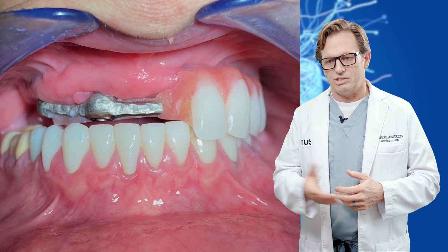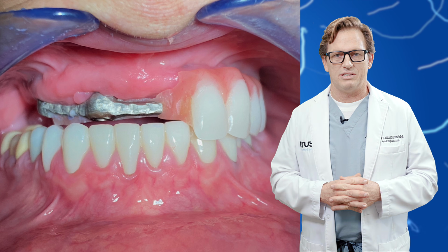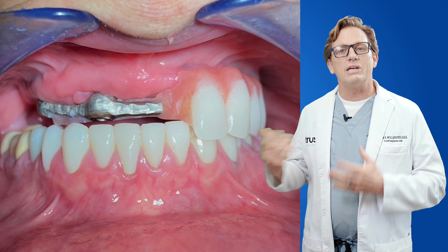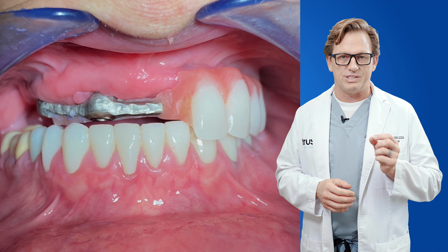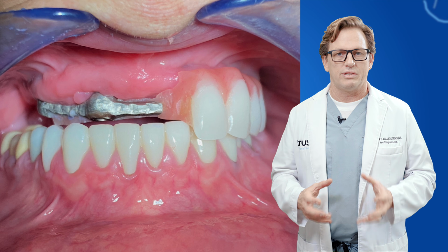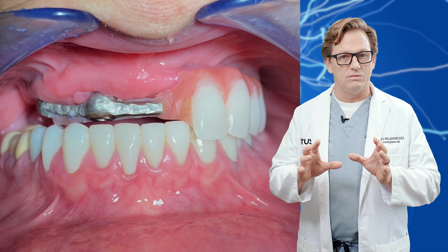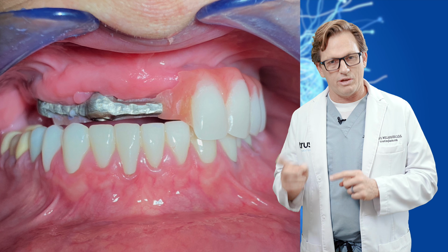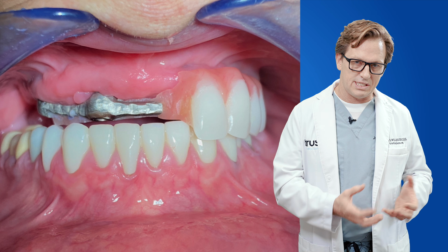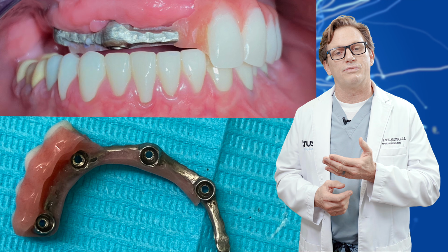And so you'll notice here she's missing a whole section of teeth in her mouth. And this was a case that was done recently. It wasn't that long ago. So take a look at the inside of the mouth. You can see she's got implants, but the prosthesis has failed. So the implants themselves have not failed, but the distribution of those implants, where they're placed in relation to the prosthesis or the teeth, is not accurate. And as a result, again, she's chewing on her front teeth.